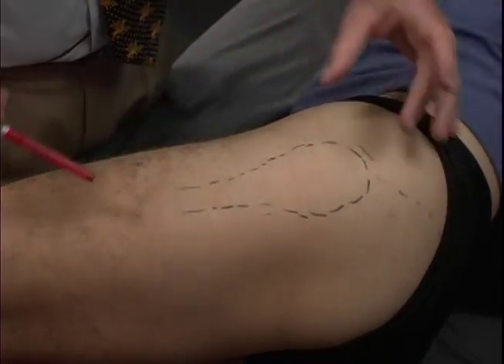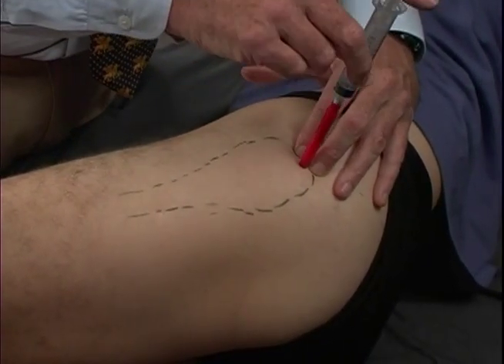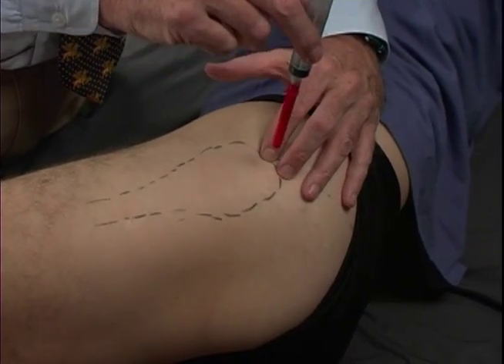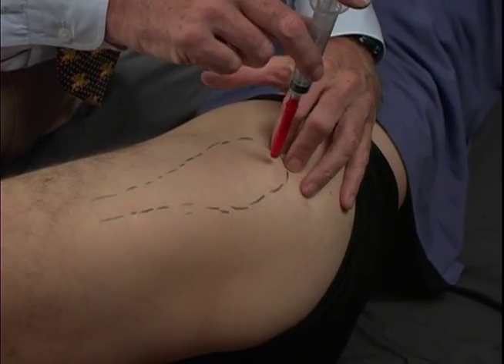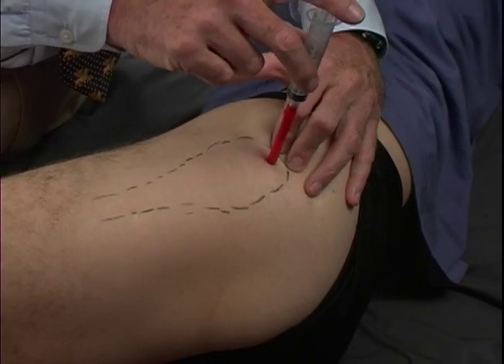When we're injecting this area, then, we need to find as close as we can to the top of the trochanter, and we need to come in with our needle and then come back out to the skin level, slide up in again until we drop off the edge of the trochanter.